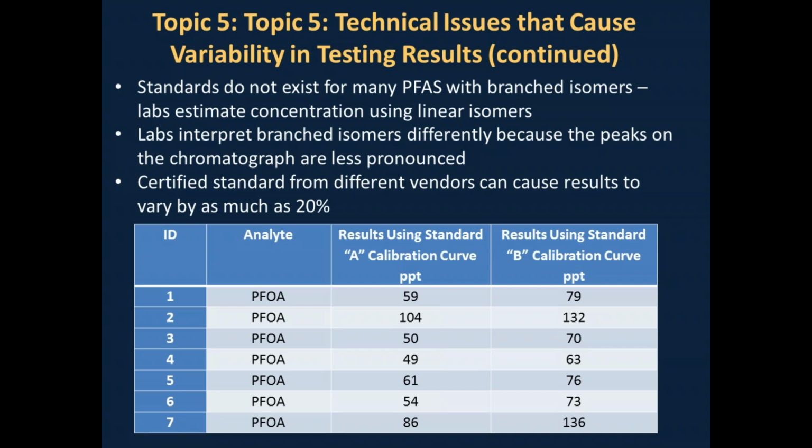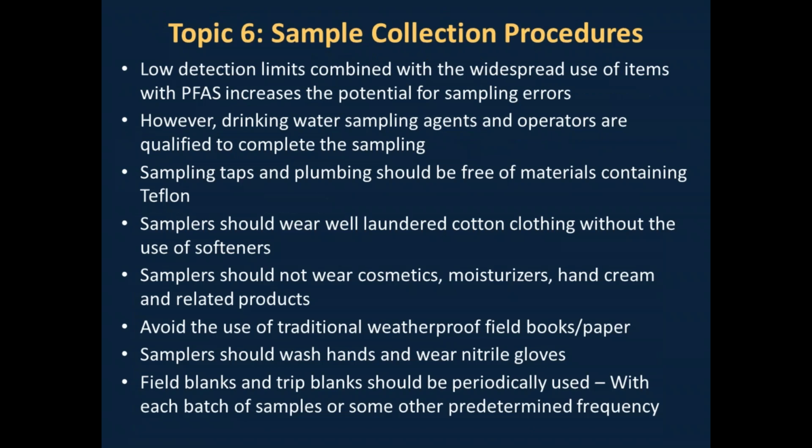We also have worked with one lab to see where certified standards from different vendors were off by as much as 20% from one another. So right out of the box, you had variability just from the standards that the lab was using.